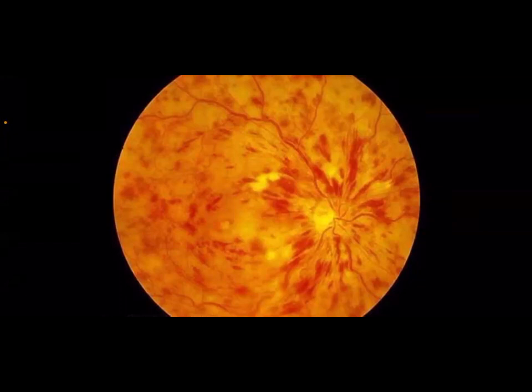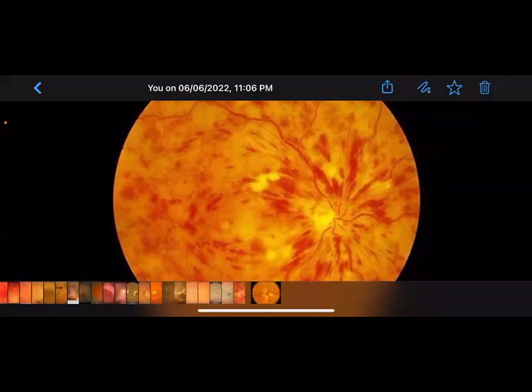Whenever the ophthalmologist touches the pupil, it will never be the same as before. It will be irregular. It will lose its circular shape. So I found the pupil is irregular, but I did not focus enough to detect the implanted lens.